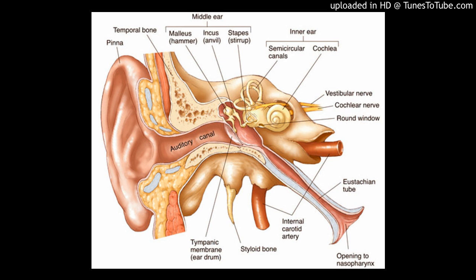Careful design and construction of the mastoid cavity. This is essential for the health and integrity of the protective sheet of migrating, keratinizing epithelium which lines the distorted ear canal. This requires the surgeon to saucerize the cavity. A high facial ridge and an inappropriately small cartilaginous meatus are obstructions to epithelial migration and are particularly high risk factors for failure of the self-cleaning mechanism of the external ear.